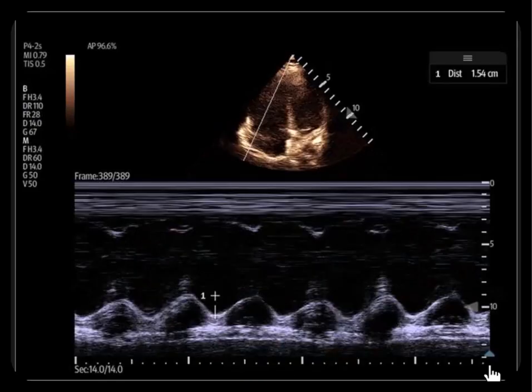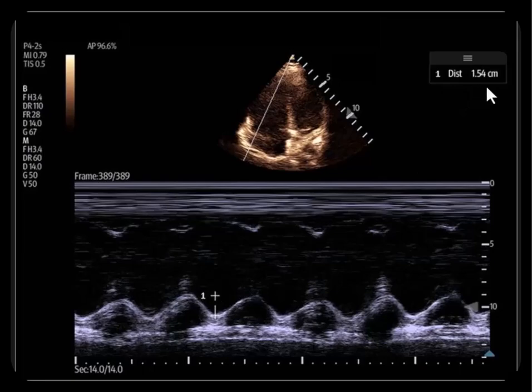In this patient, we went ahead to measure a TAPSE. The TAPSE, when measured from peak to trough, was 1.5 centimeters or 15 millimeters, less than 17. So this is considered significant right ventricular dysfunction. Let's look at another clinical case from our department.